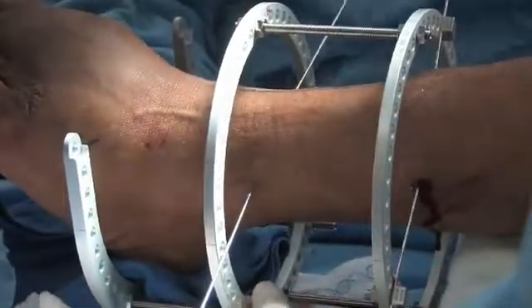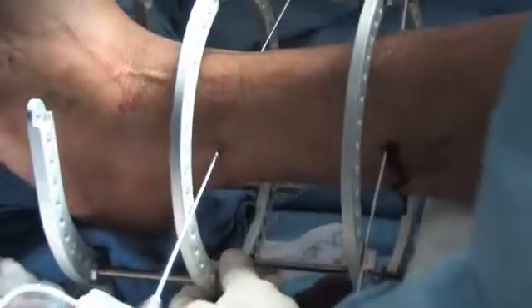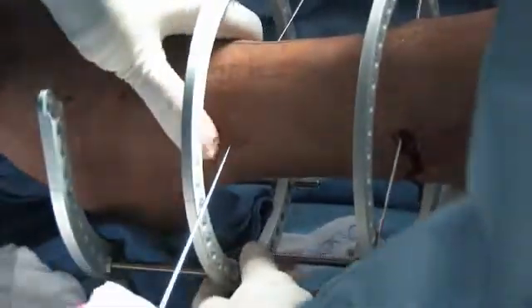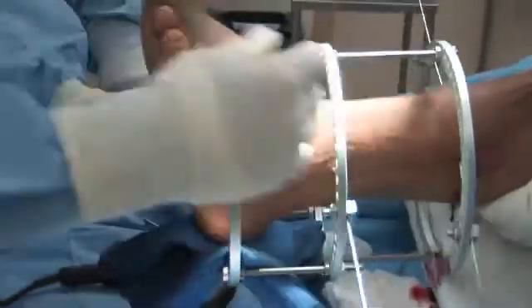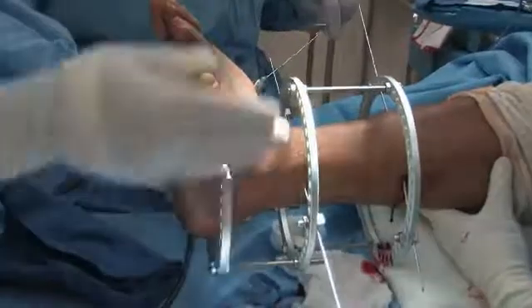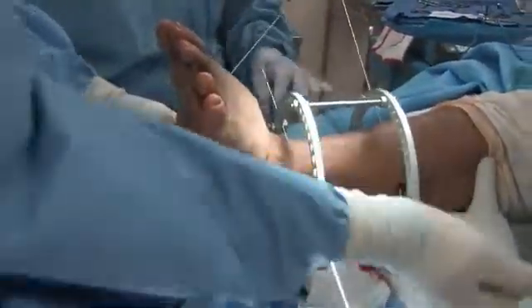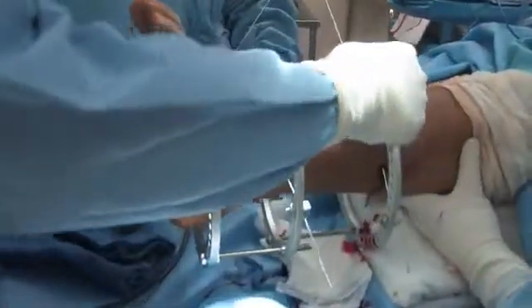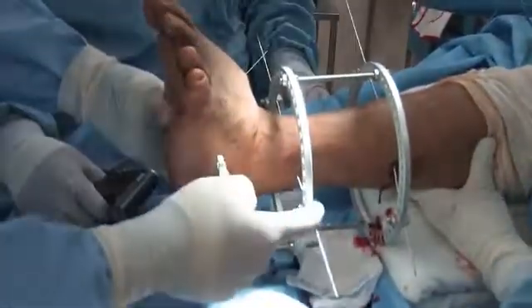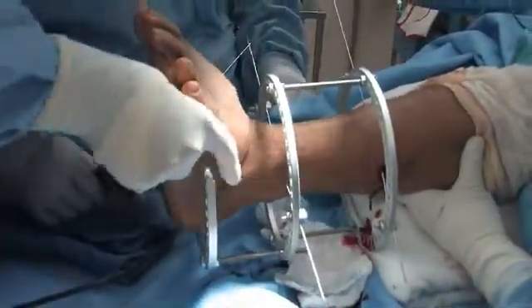Here's your 15 back. So now what we'll do is we'll put our wire fixation bolts on these. We have another olive wire. So what I'm looking at here is we've got space between our foot plate and our heel. We've got the alignment of our threaded rod with our tibia, and we've got space. We still haven't burned a bridge. We can move the frame medial or lateral if we need to, anterior, posterior, by removing the nut and bolt and moving it back. So I like the position we're in.